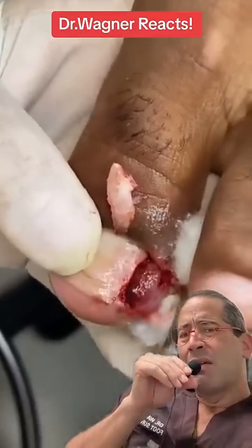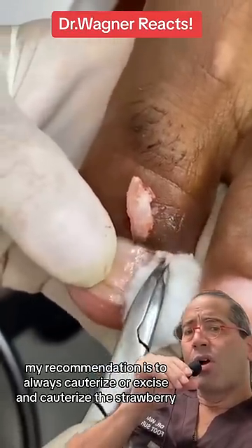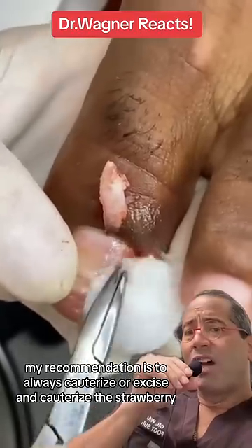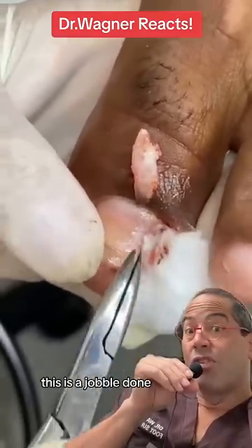At this point, my recommendation is to always cauterize, or excise and cauterize, the strawberry — the pyogenic granuloma. This is a job well done.